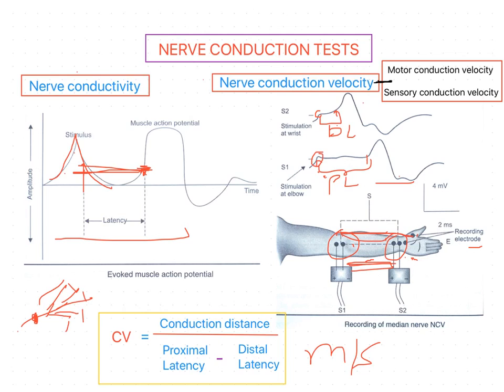All these values are calculated from the digital sensory nerves. For the purpose of sensory nerve conduction velocity testing, the electrodes used for the motor NCV test can be used, or digital ring electrodes can be used.